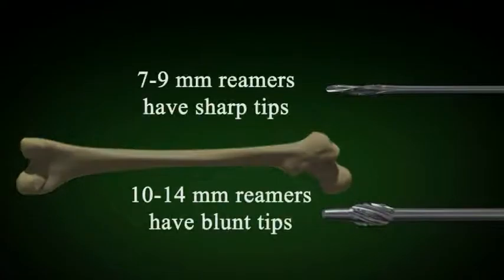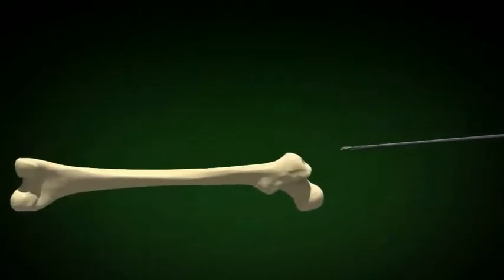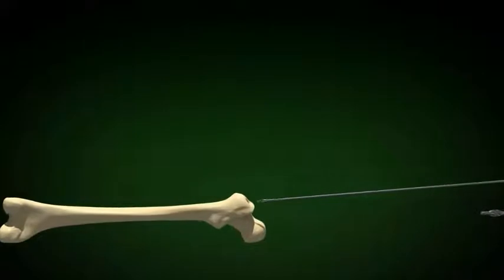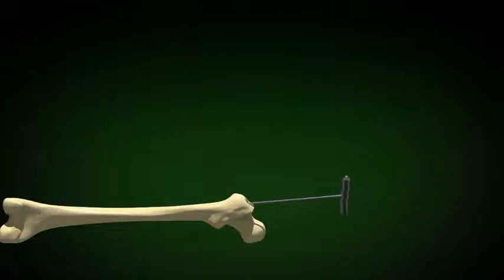There are pointed reamers and blunt reamers. The smaller reamers are pointed so they can penetrate from the metaphysis to the canal of the femur. Rotate the reamer in a clockwise direction when inserting the reamer and when removing the reamer. Do not oscillate the reamer.